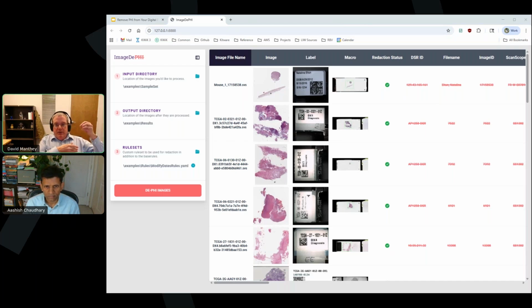So in this case, we don't decode the image. We say, here's the image data, copy it into the new file. Here's the metadata. The metadata we completely rewrite.